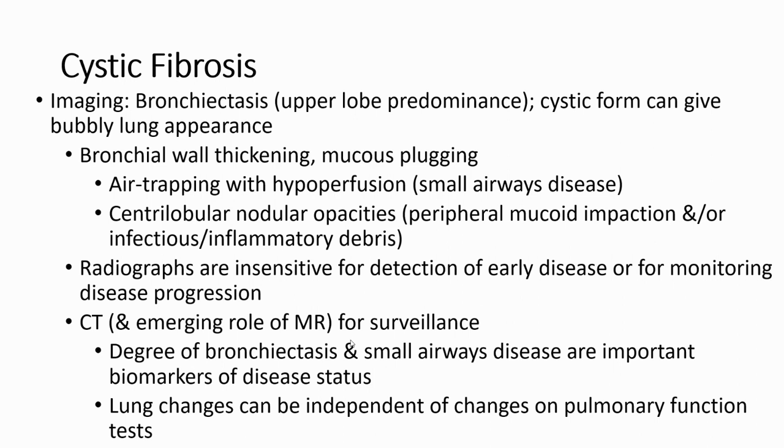We also find bronchial wall thickening and mucus plugging, which cause air trapping with hypoperfusion, and centrilobular nodular opacity, mostly in the periphery, from mucoid impaction and or infection and inflammatory debris.